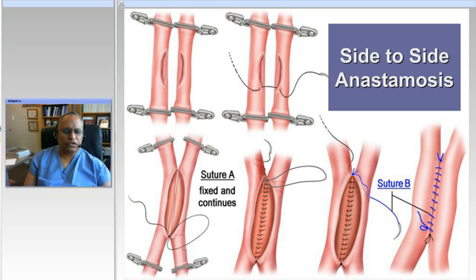And then you will suture from the inside. This is showing a lot of stitches. You really normally don't need quite so many stitches as you've seen here, probably only less than half this number. And then you finally emerge on the outside again. You tighten all of these stitches, and then you tie it, and then you come on the outside.